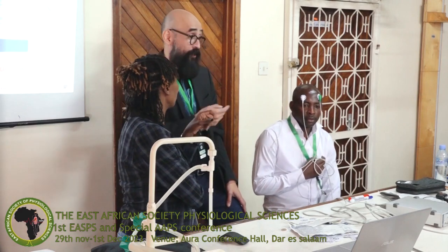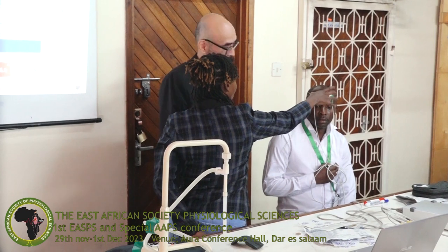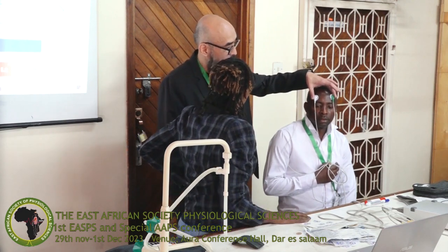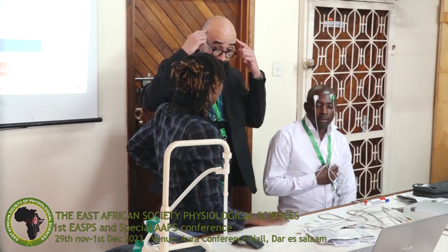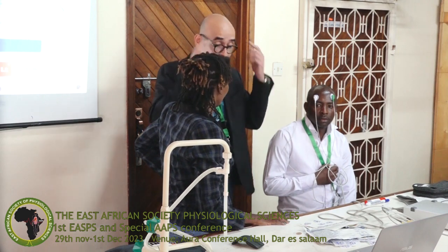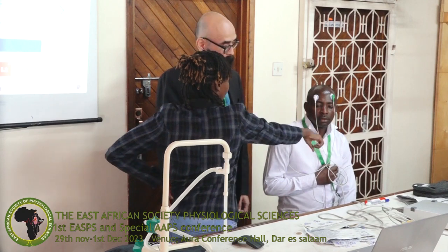Can we use this one that is recording the frontal activity? Yeah. So can we remove them and put them at the temporal? Switch the electrodes. For this size of electrodes that we have, you will pick up more or less the same signals. If you take a look at what a research-grade activity would be, it would use smaller electrodes with more conductivity, usually gold plated, in order to increase the amount of signal. So can those PowerLabs support the same thing but using different electrodes?